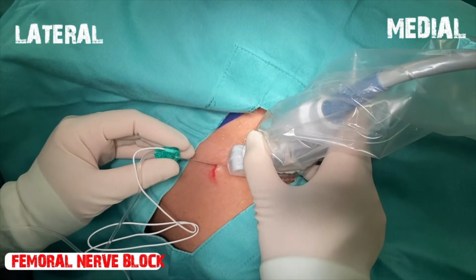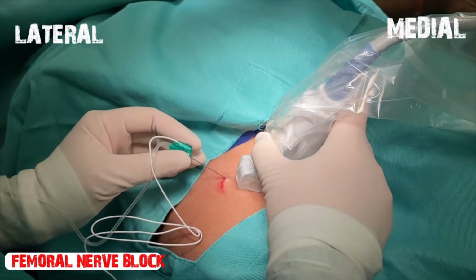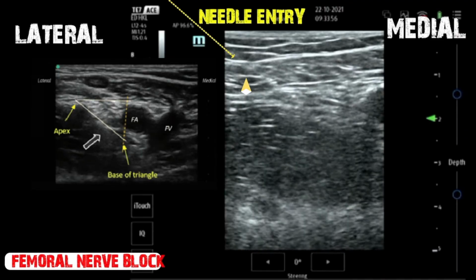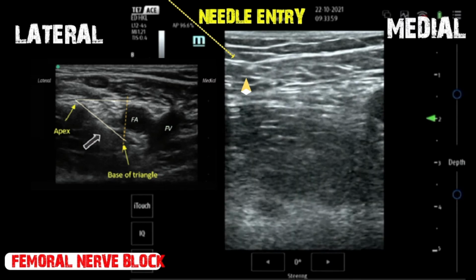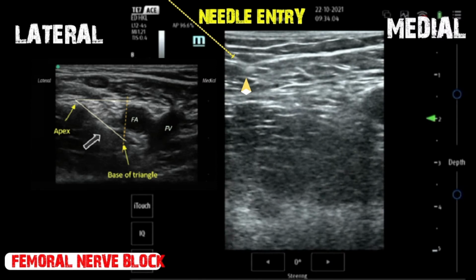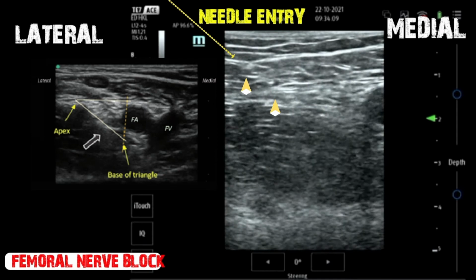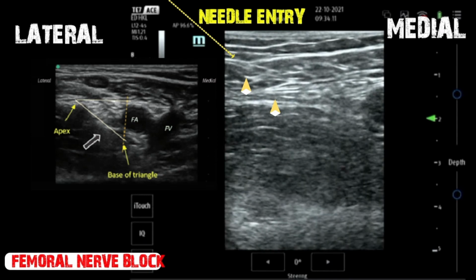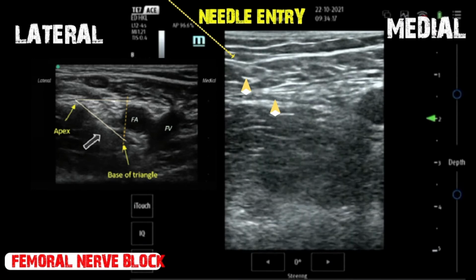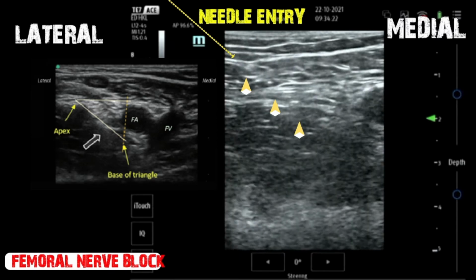Needle insertion point should be about 1 cm lateral to the transducer in a lateral to medial orientation and not nearer. If needle is inserted just next to the transducer, a broader skin to needle angle trajectory will cause considerable degree of undetected reflected echoes being diverted away from the needle. Targeted needle entry area should be at apex of the triangle, which consists of fascia lata iliaca complex.